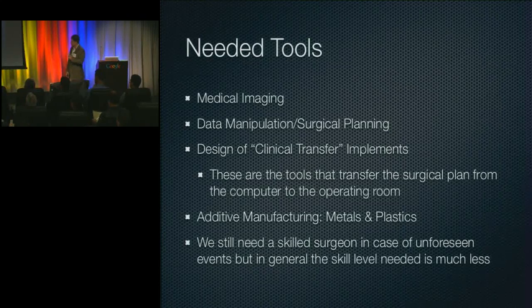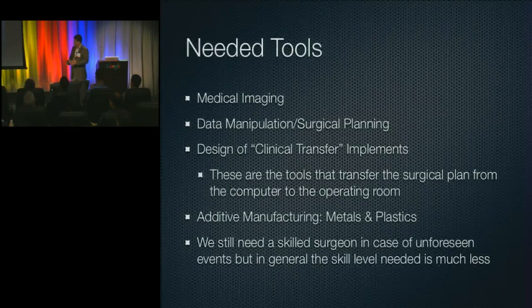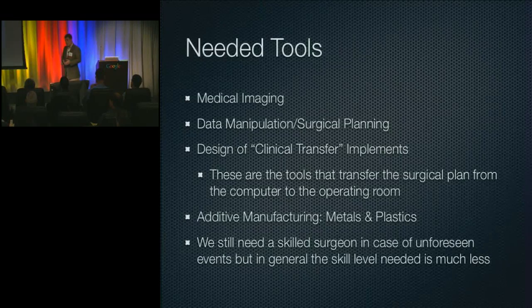But for metals, we'll focus a little bit on direct production of implants, which is a key area that will continue to grow in the medical field, on the manufacturing side. That means converting what are typically all the old techniques, the same as in aerospace, so casting, forging, and machining are all very typical in the medical area. But more and more, there are things we can do additively that you just can't do otherwise, and those are clear indications for moving to additive metal. But there are also things that you can do better or faster or cheaper additively than you can with other techniques.